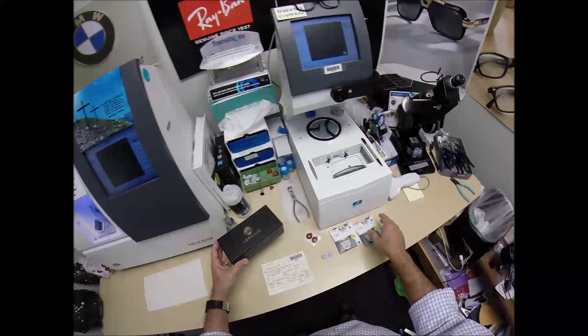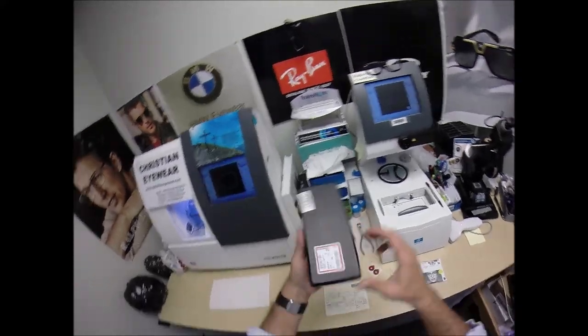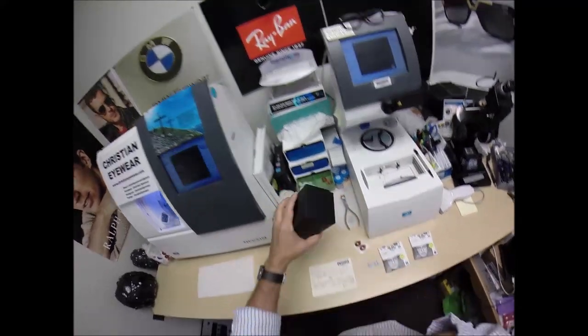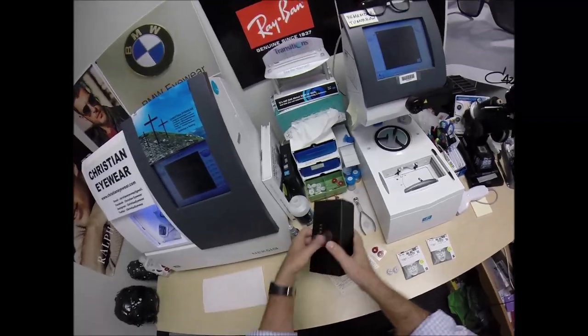I'll be cutting your high index 1.67 lenses with DuraVision Platinum for your Versace 3218, size 53, color 5122. And of course, I forgot to write that on your temporary card here, which is the black and platinum — the black and silver.